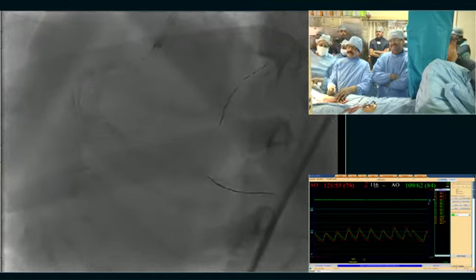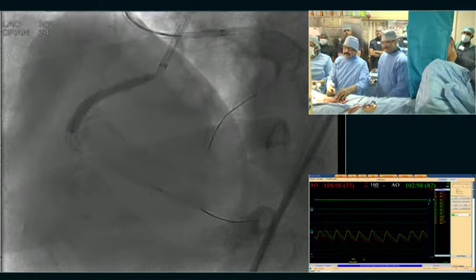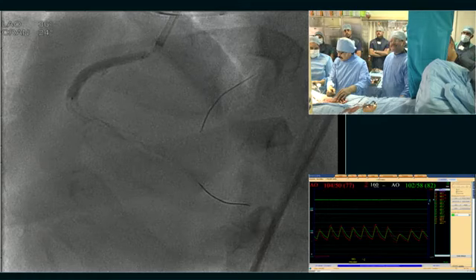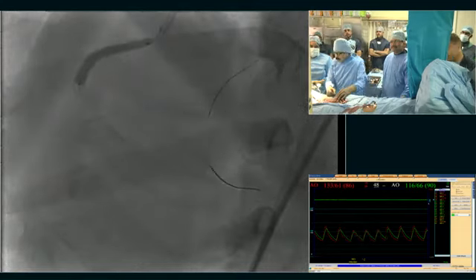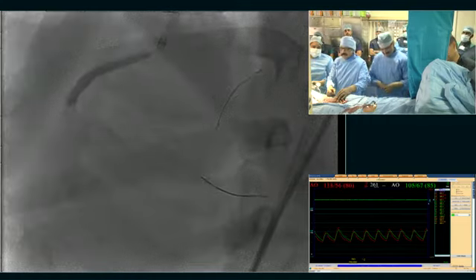So what will be your strategy for the posterolateral branch? I will do a dual lumen catheter and open the PLV. Not an issue. Okay, maybe a plain balloon dilatation of the vessel first. It is filling nicely from the other collateral, the left epicardial collateral system. But even then, as you said, we have to open it.